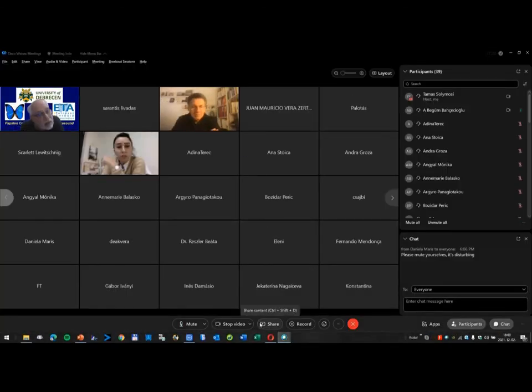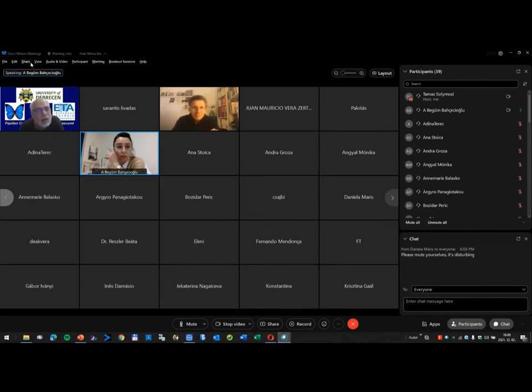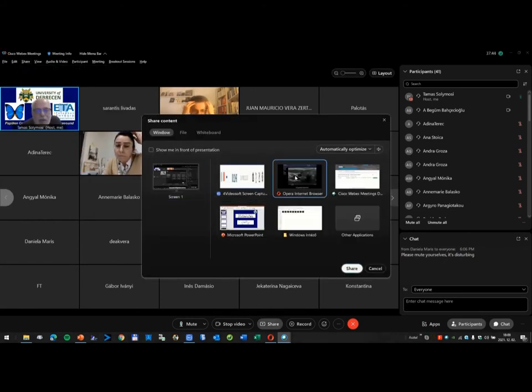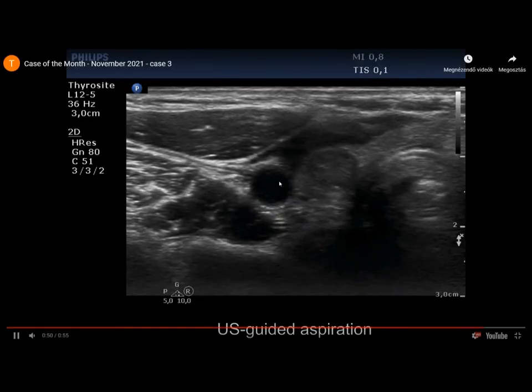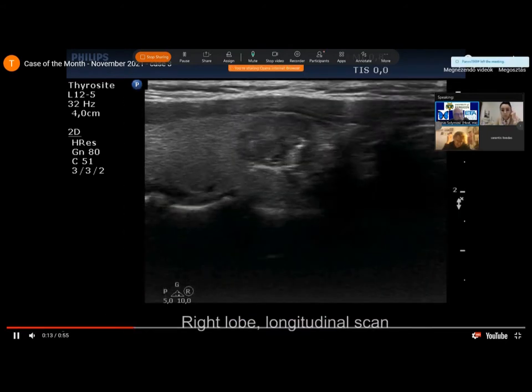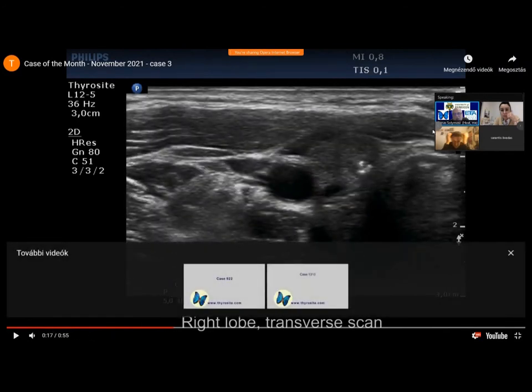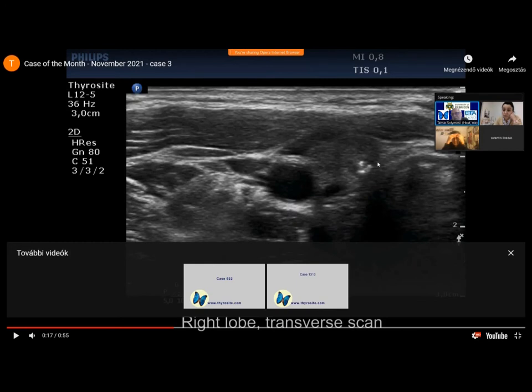I think these echogenic teeth are bigger than microcalcifications — more than one millimeter. No, I don't think so. Here is a granule, and one centimeter is from this line to this line. This is clearly smaller than one millimeter. So this is one centimeter, and this is clearly less than one millimeter in diameter. Always look at the caliber. This is surely less than one millimeter in diameter.